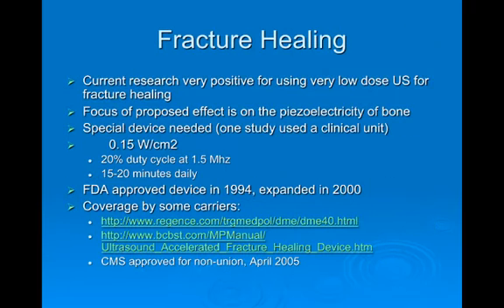Okay, so it brings us up then to another application, and that would be fracture healing. So current research, very positive for this, but it's using a very, very low dose here. So we look at 0.15 watts per square centimeter at a pulse duty cycle, and using this for 20 or so minutes a day. It's received FDA approval as a device. This is typically done with a special device, not your clinical applicator.